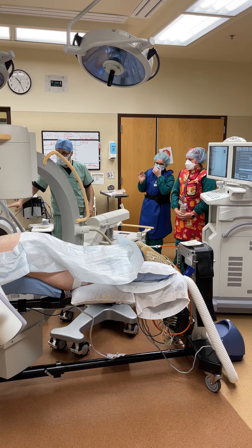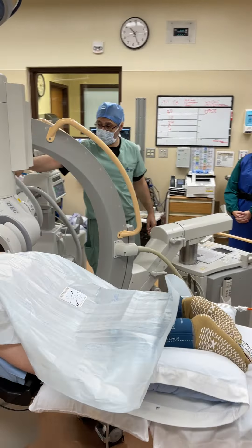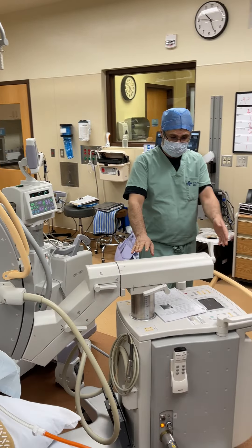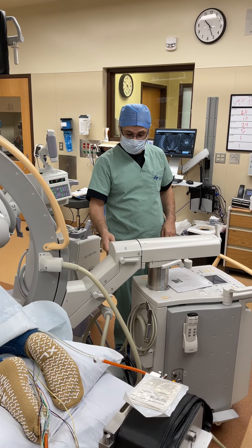This is slide, this is weight, this is tilt, this is the arc. I call this front two, I call this back two. Same here: back two, front two. This is obviously the arc and here is the tail.